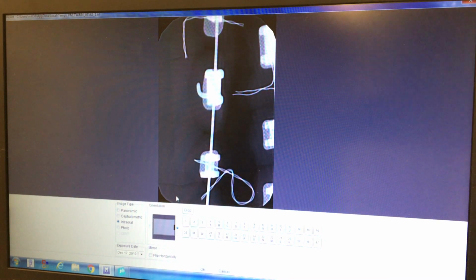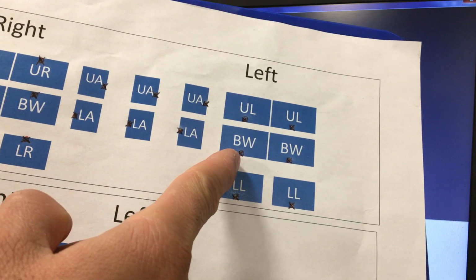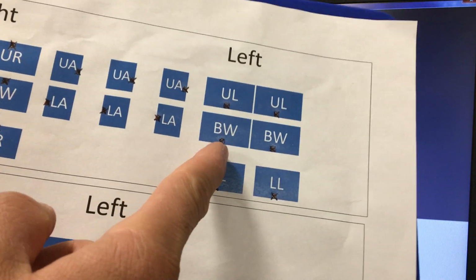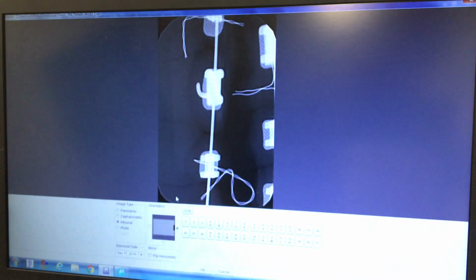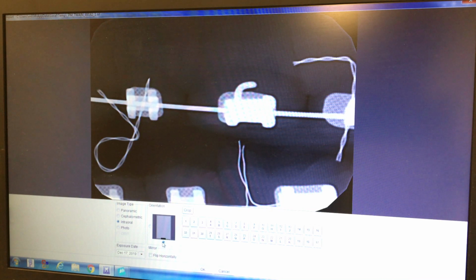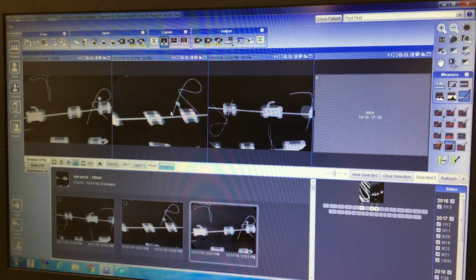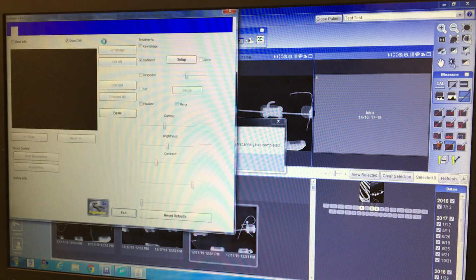So on the left bite wing, the arrow points down. So you want to select that bottom orientation, which is here where my mouse is. Click on that. It will rotate the picture to the right orientation. Click OK. I'm going to be on my last bite wing here. So I'm going to start capture scan again.